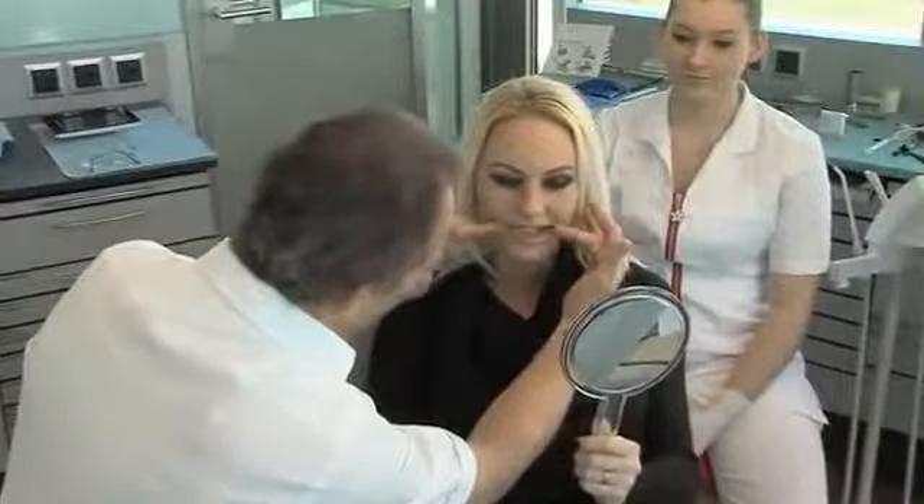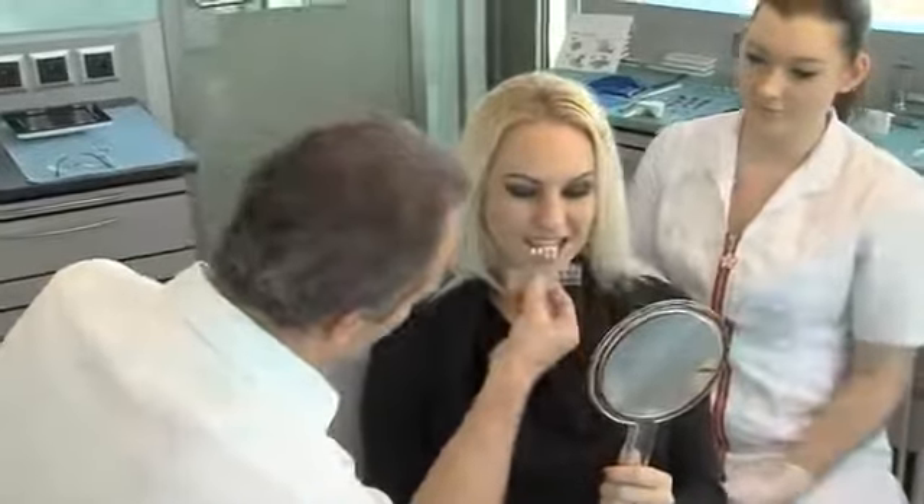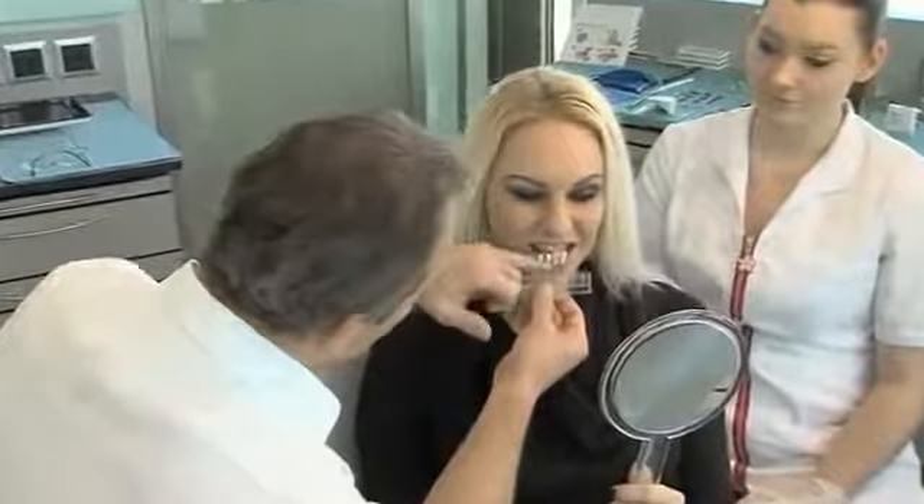Facial symmetry is discussed at the start of treatment with the patient — the alignment of the occlusal plane to the bipupillary plane and the midline. Patient and dentist can jointly select the target shade using the Coltene Componeer shade guide.